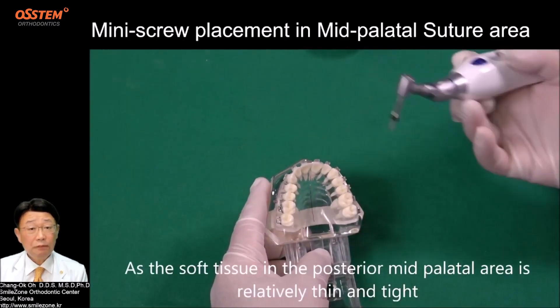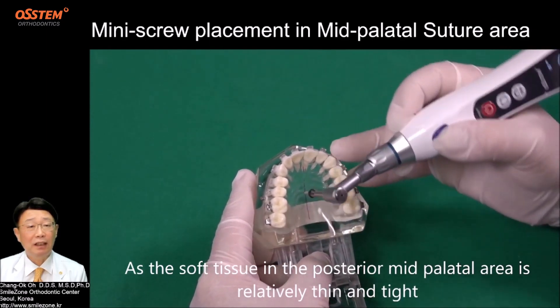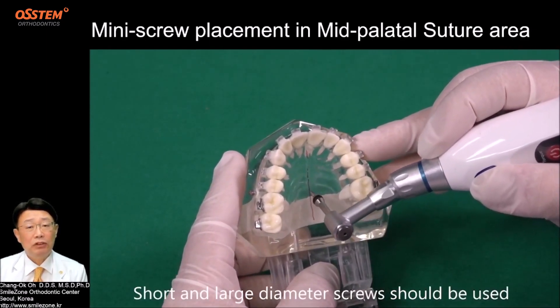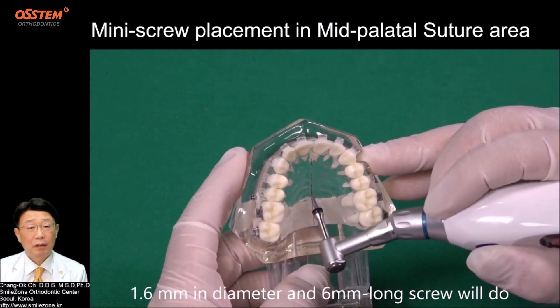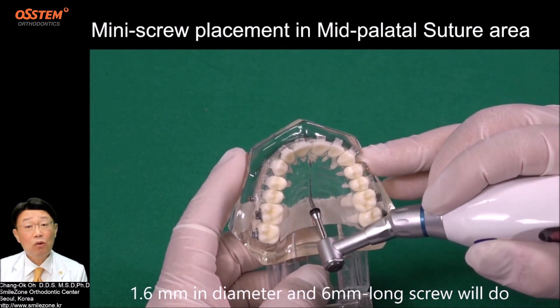As the soft tissue in the posterior mid-palatal area is relatively thin and tight, short and large diameter screws should be used. A 1.6 mm in diameter and 6 mm long screw will do.